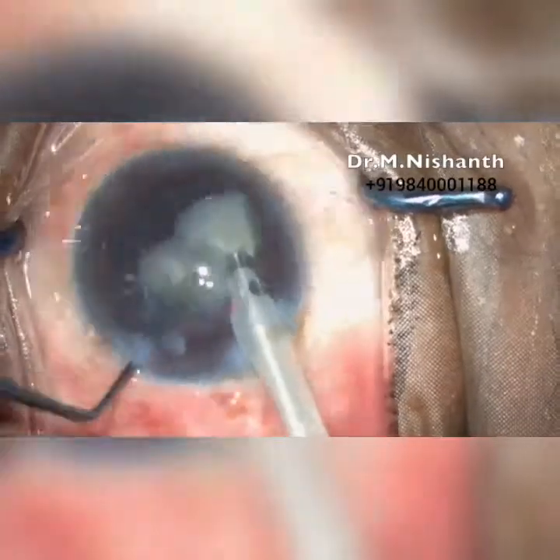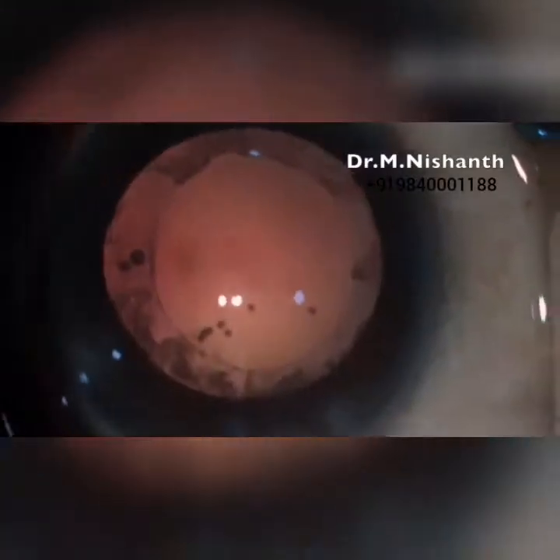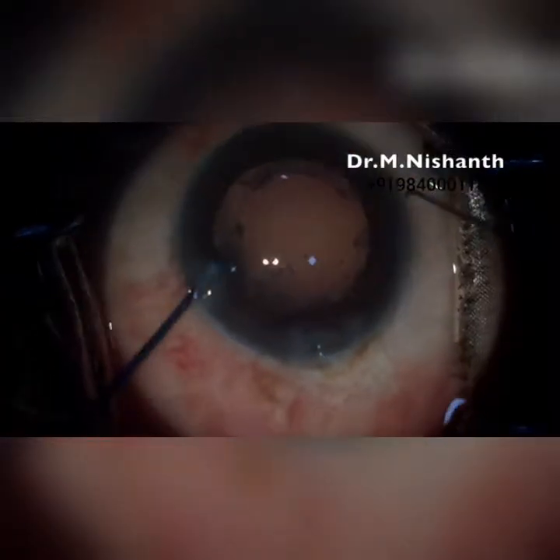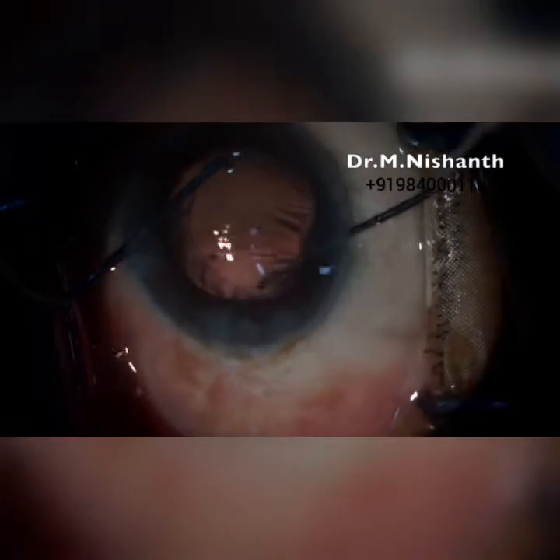Make sure the probe is in the center of the eye. The rhexis margin and bag integrity are maintained strong throughout the procedure.